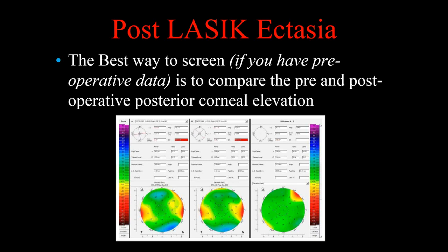Okay, thank you. So we have a question going back to the toric calculations. Do you ever use the total corneal refractive power for against-the-rule astigmatism or oblique astigmatism? Yes. Good. Okay.